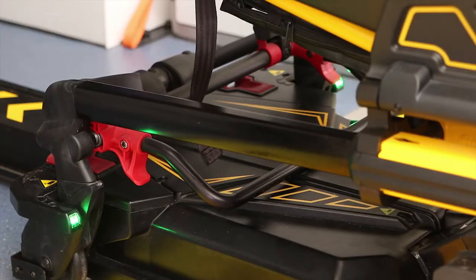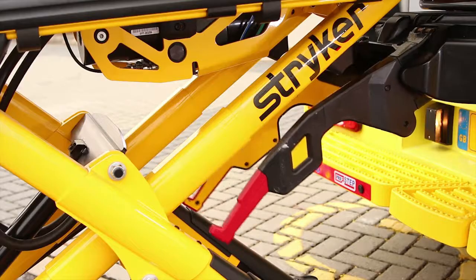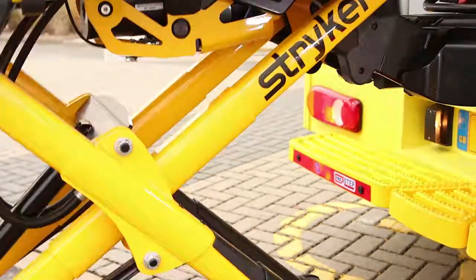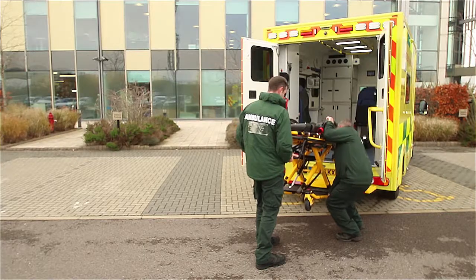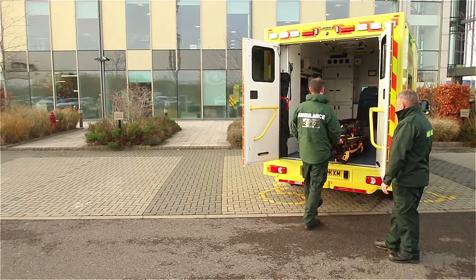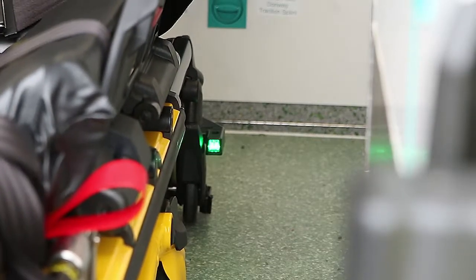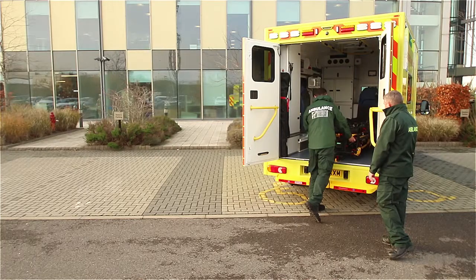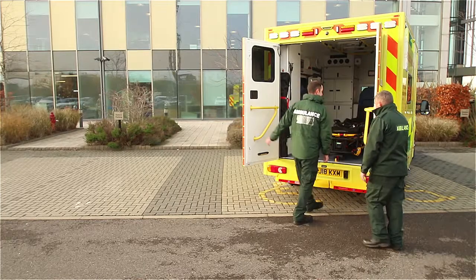LEDs on both sides need to be solid green. Locate the control panel on the PowerLoad and press and hold the up arrow button to raise the lifting arms. Locate the red manual override release lever on the stretcher; one operator squeezes the lever while the other manually retracts the stretcher legs fully. Guide the stretcher into the vehicle to the end of the PowerLoad transfer until it comes to a complete stop. You will hear a positive click and the PowerLoad will lower into the locked position. Make sure the stretcher is locked by firmly pulling side to side on the foot-end.